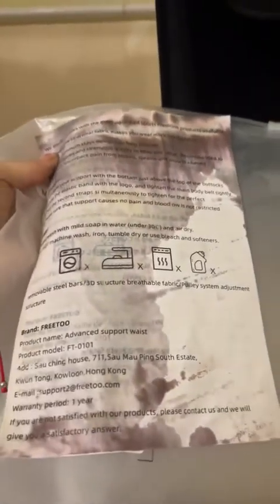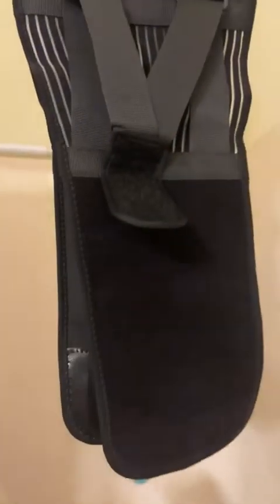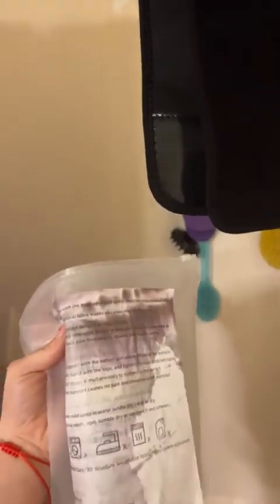This is what the back brace came in — it was completely soaked in oil. Even the instructions are soaked, everything's soaked. It smells really strong, like a mechanical oil, and the entire back brace is soaked. This was on the inside of the package, not from the outside — the outside package was all plastic. So this came from where it was packaged.